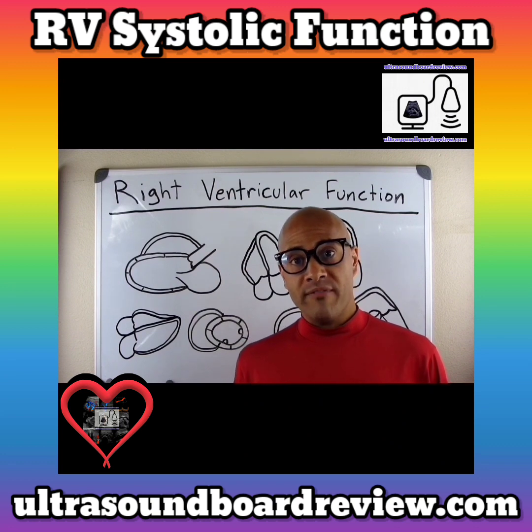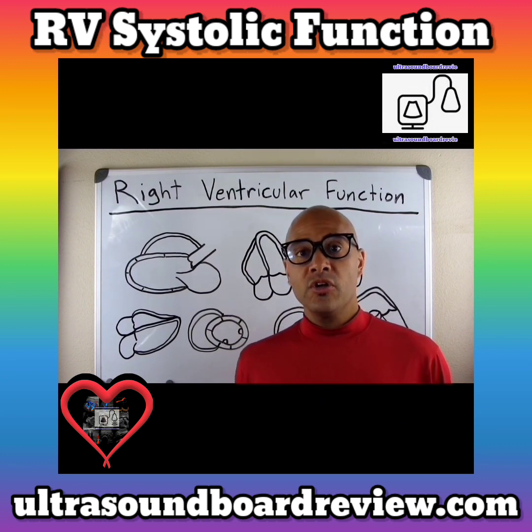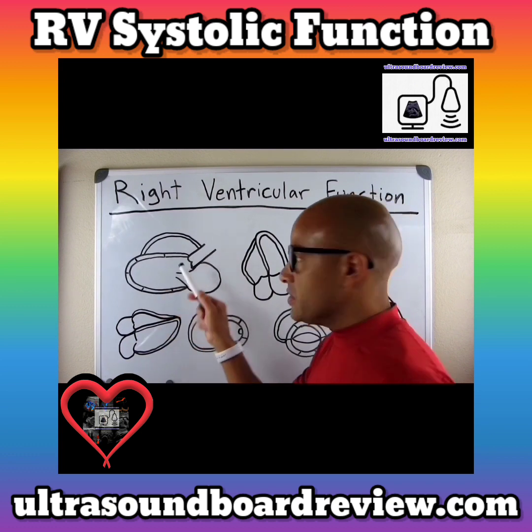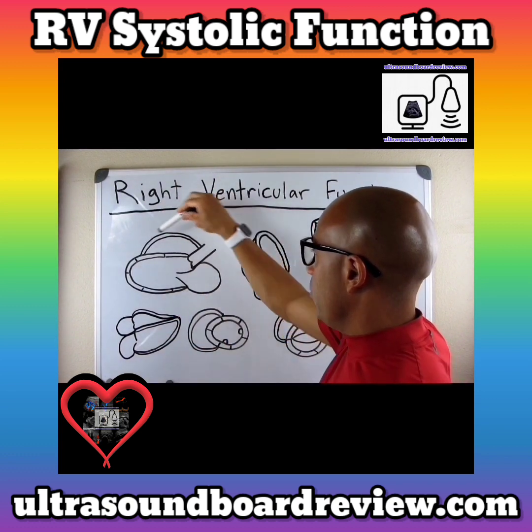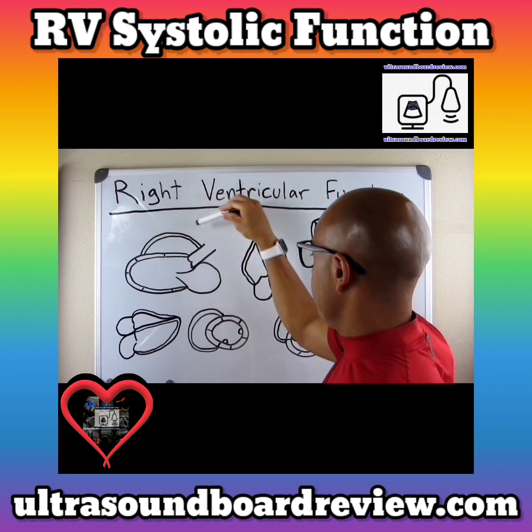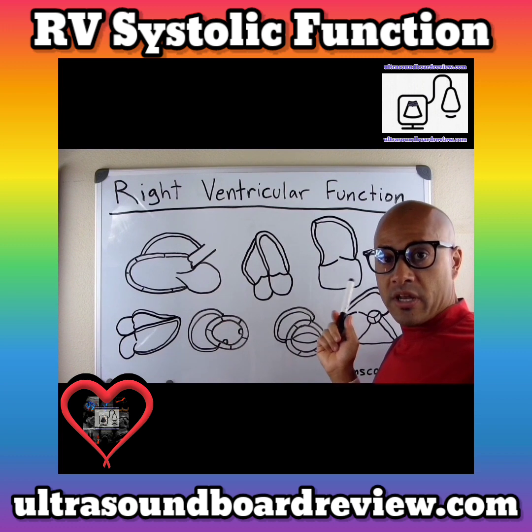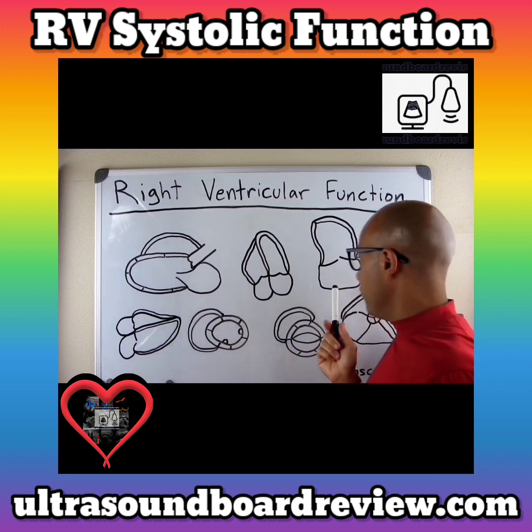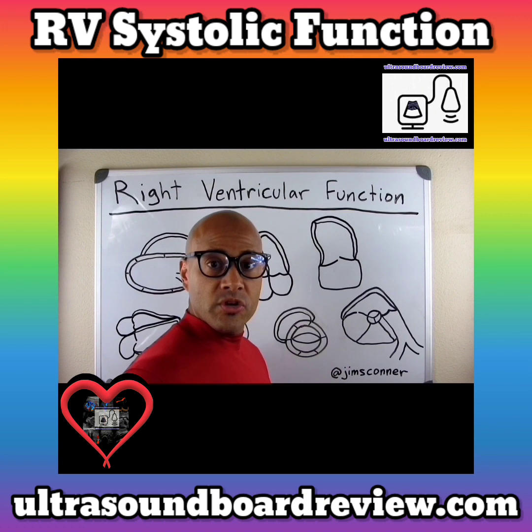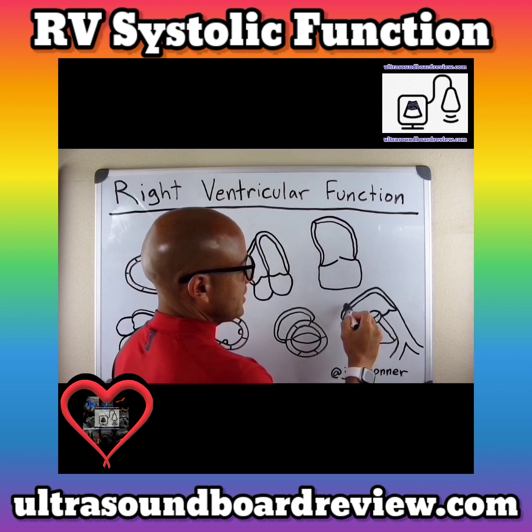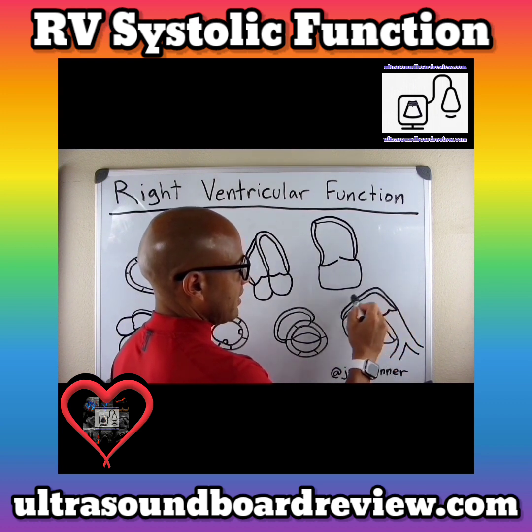In order to determine right ventricular systolic function with echocardiography, you're going to want to obtain as many views as possible. You'll want to start with the parasternal long axis, in which you will see the anterior wall of the right ventricle. Then you'll obviously want to get the apical four-chamber view. You'll also want to get a good view of the RA-RV inflow. In the short axis view, focus on the RV walls — here at the aortic level you can see the wall connecting to the pulmonary artery.